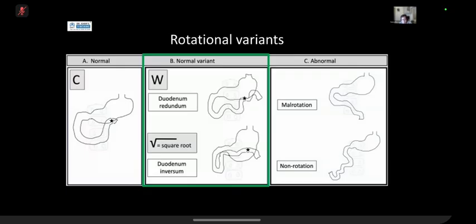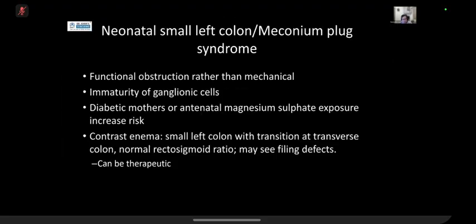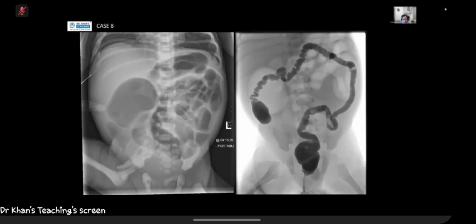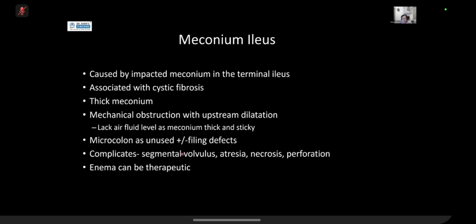Meconium complications. So meconium complications, you get calcification, intraperitoneal calcifications, you can get pseudocysts. What else can you get? I think those are the main ones I can think of. Sorry, going back. Volvulus, I guess, maybe you've got adhesions, you can create volvuluses. That's why I think atresias are so common. Is it truly a complication of meconium ileus or of some sort of ileal atresia? It's debatable, but I would think of meconium complications mainly as perforation with peritoneal calcifications and pseudocysts.